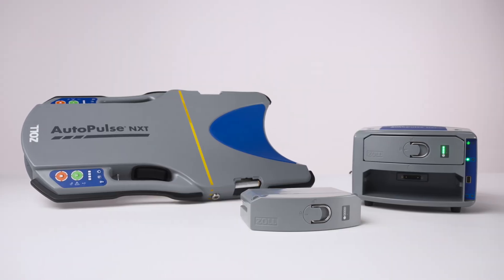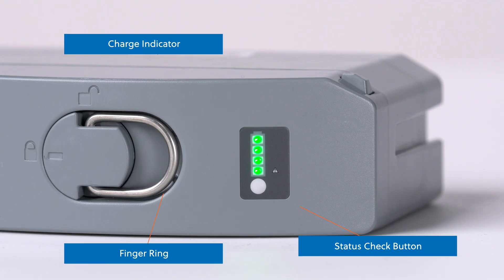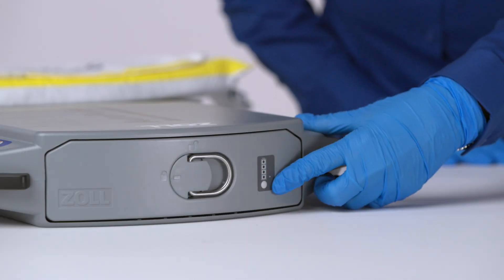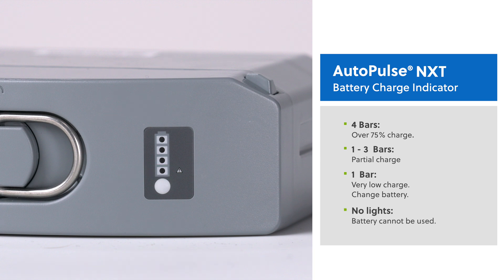When using the AutoPulse NXT system, you can check the battery charge status on the battery itself or in the battery charger. You'll find the battery charge indicator on the face of the battery next to the finger ring. This remains visible while the battery is in the platform. The number of lights illuminated indicates the charge level. Four green bars mean the battery has over 75% charge. One to three green bars mean the battery has a partial charge. One bar means the battery's charge is very low and the battery needs to be changed. If no lights appear when you push the button to check the charge status, the battery cannot be used and it should be replaced.